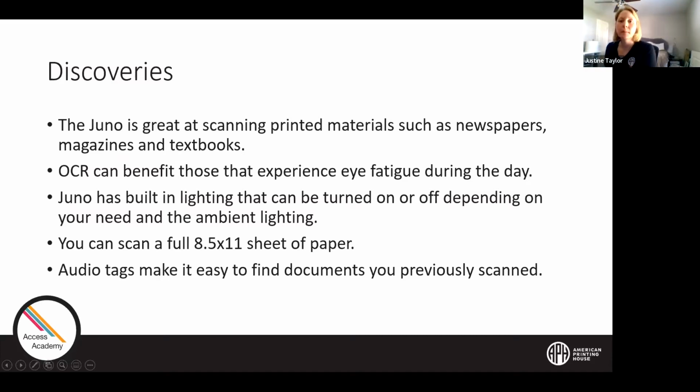We had 3 questions for you. For the first question, how often do you or your students or clients use OCR on the Juno? The majority, at 64%, said not at all, but hopefully this webinar has really shown you the benefits of using OCR, and especially the benefits of Juno being one of the only devices on the market that is as small and compact as Juno is, with this very powerful feature. Is there a skills performance checklist available to monitor student progress? 17% said yes, 17% said no, and 67% said I don't know.